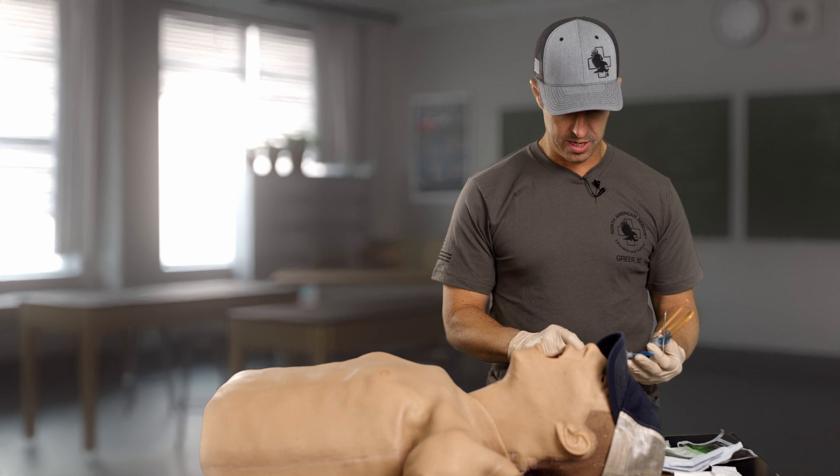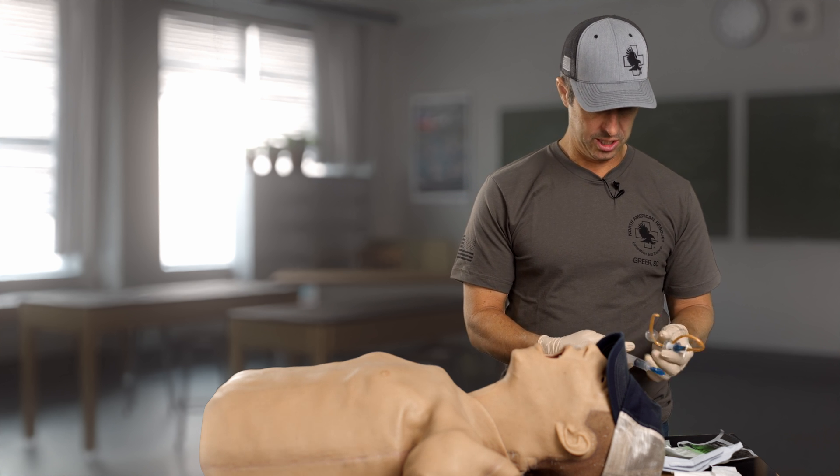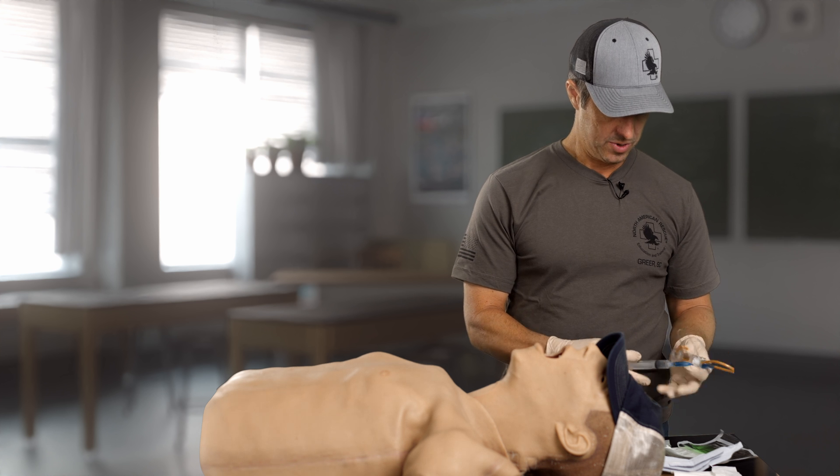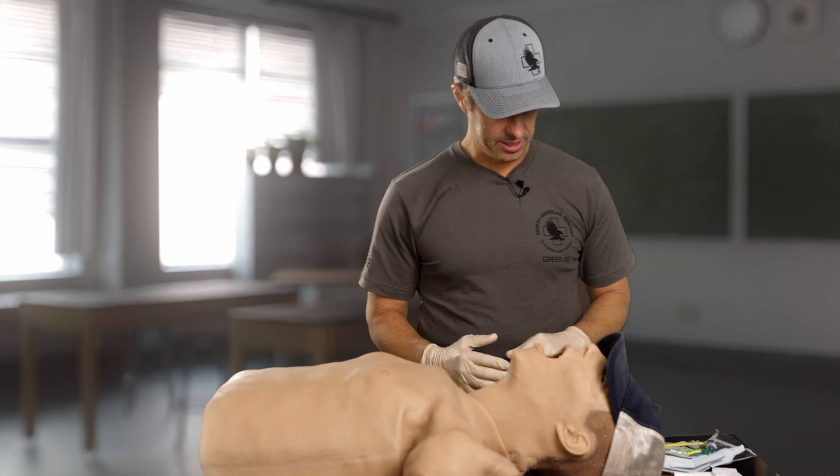I've already hooked up my syringe to the balloon. I test that balloon just to make sure it looks good — holding air — and then I pull the air back out of it. I've got all my contents laid out.